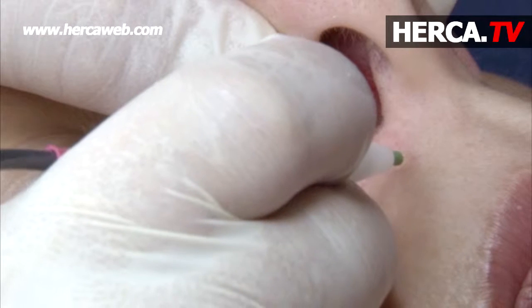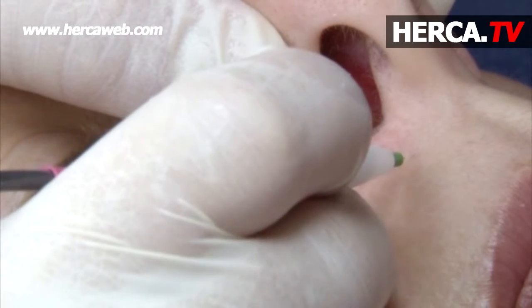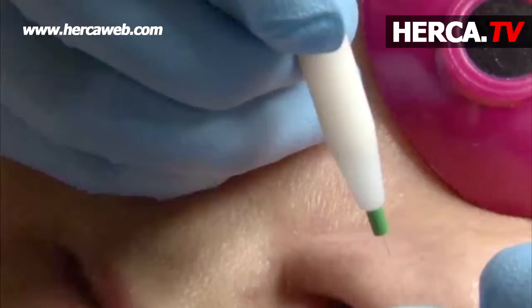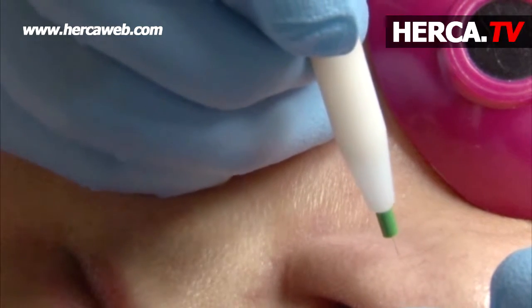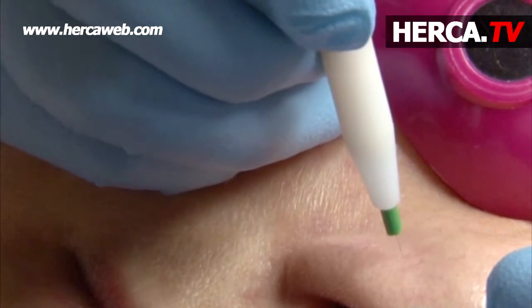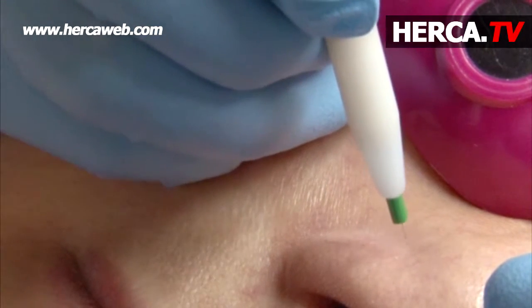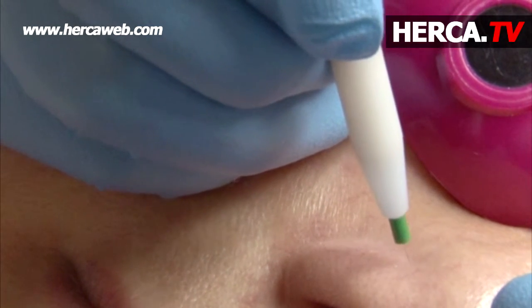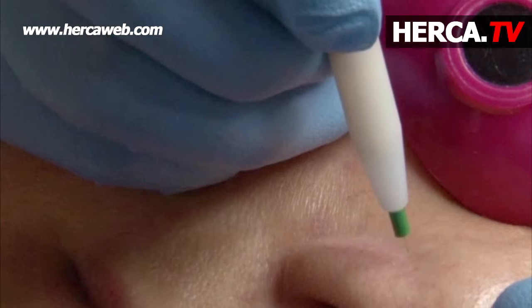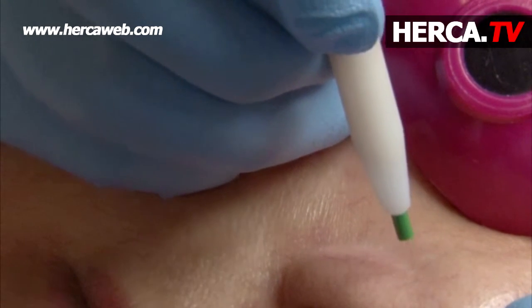But here we are with high frequency. Eyebrow: one, two, three. Next — so I go, do the same thing. If I have a thick skin with a fine capillary, always go with the bigger one. The same thing — you just didn't make the same frosting as the other one. Go close enough where it stops the whitening effect. If I have a fine one, it wasn't coagulating, I would increase by 0.002.